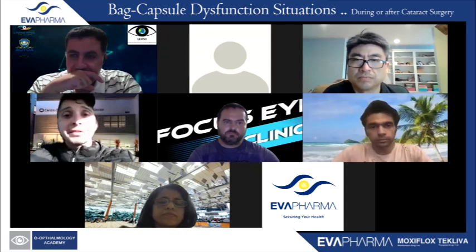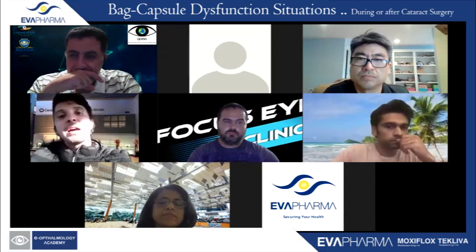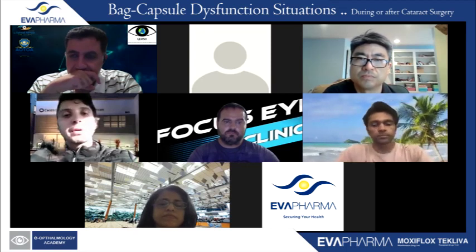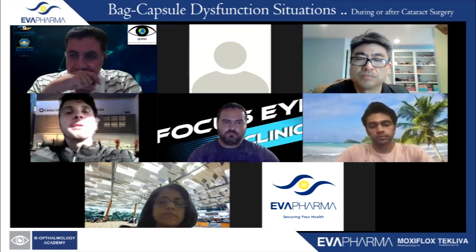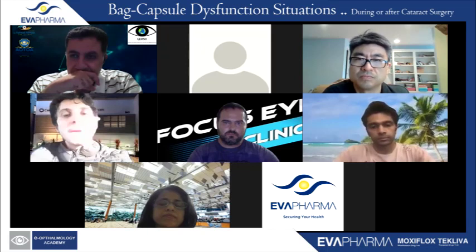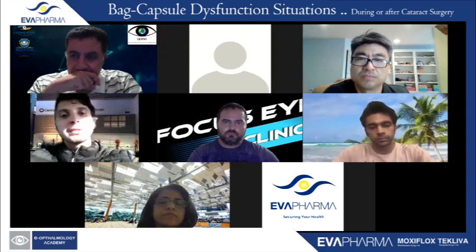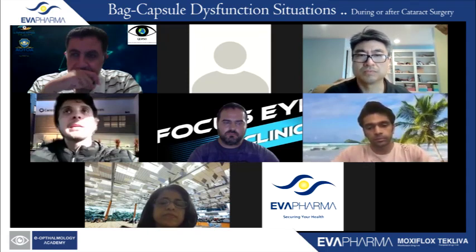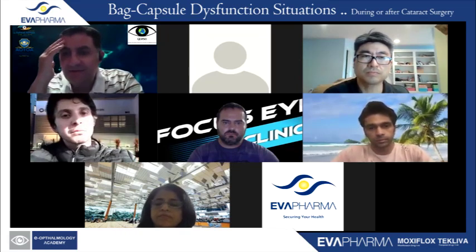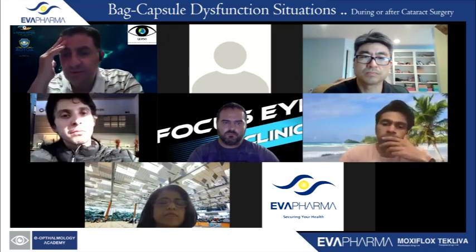So I suggest, if you have an IOL from crystalline, or a hydrophobic IOL, it is better for patients with vitrectomy. So, I mean, how stable is the flange if you are going to do a posterior segment surgery?